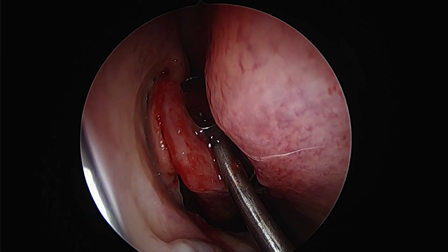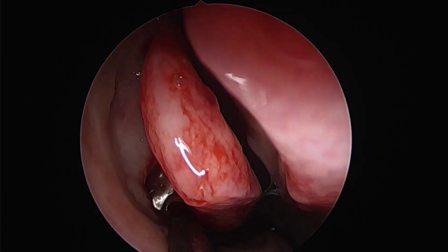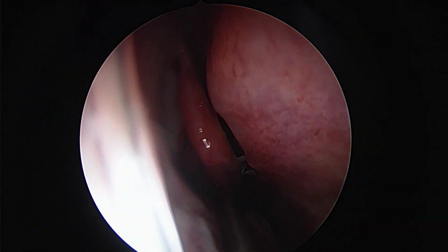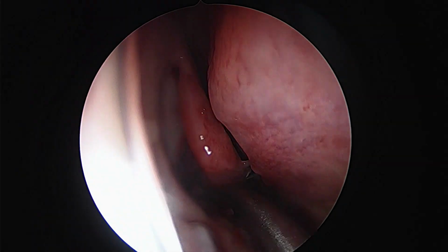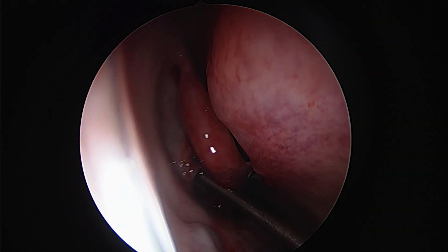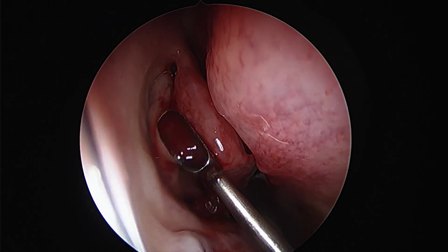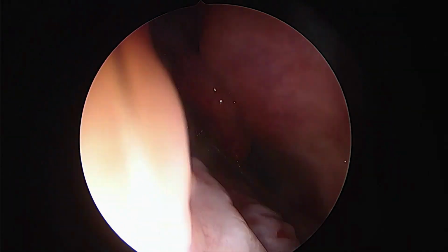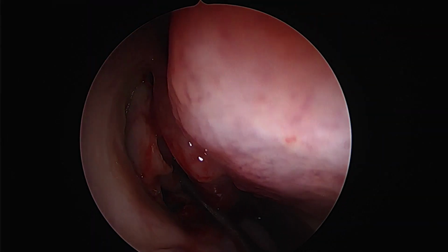Needless to say, in all such patients, a thorough exposure of the entire base of skull, the lamina papyracea and the septum is very important in defining the skull base defect, the size of it, and most importantly, the repair, which requires a lot of bare bone around the defect area.